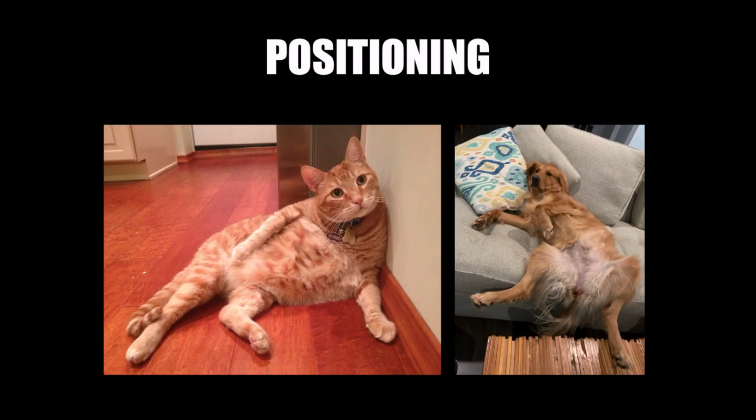Positioning for this exam is really going to be whatever position makes the baby the happiest. These babies are fussy, they're hungry, they're crying, they're going to want to move around a lot, so try to have your parents hold them in whatever position makes them comfortable and still allows you to get to the anterior abdominal wall.